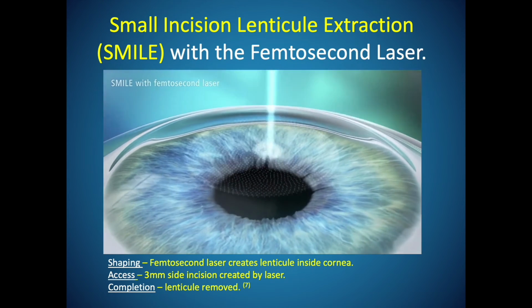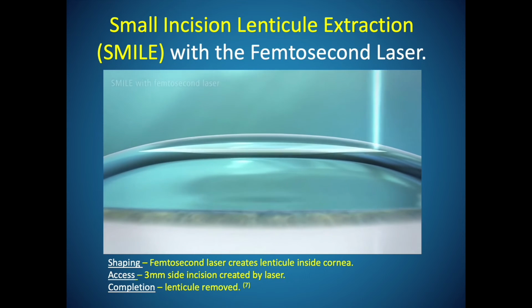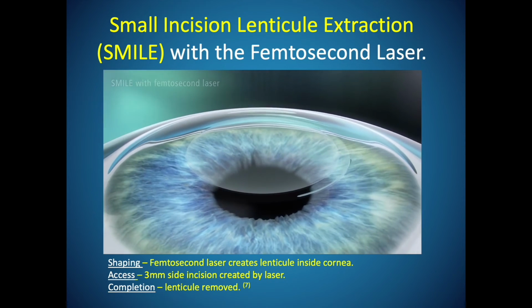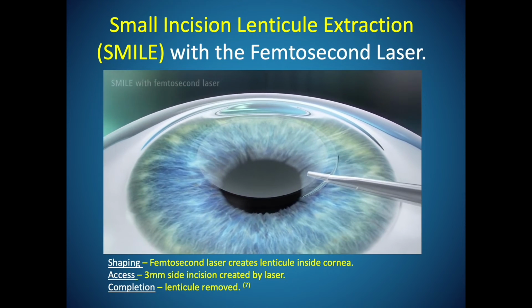SMILE is a procedure completed by the femtosecond laser, first forming a series of bubbles to create the lenticule surface within the corneal stroma, then creating a 3mm side-cut laser incision to provide the keyhole access for the lenticule to be extracted.